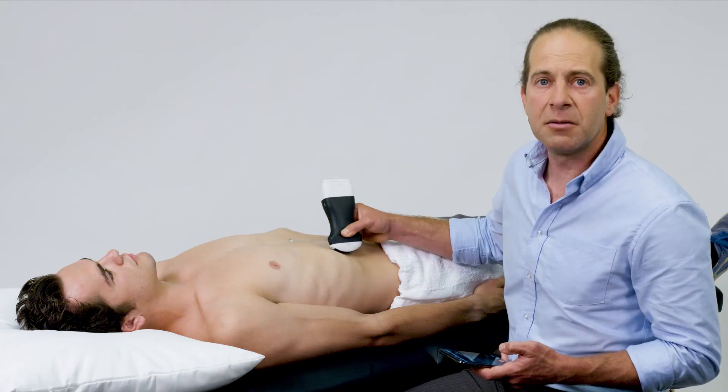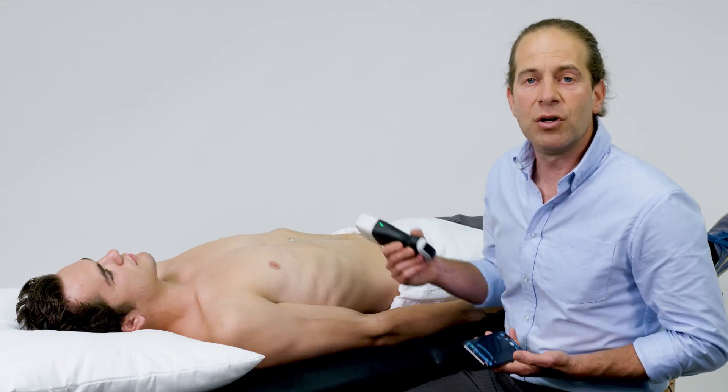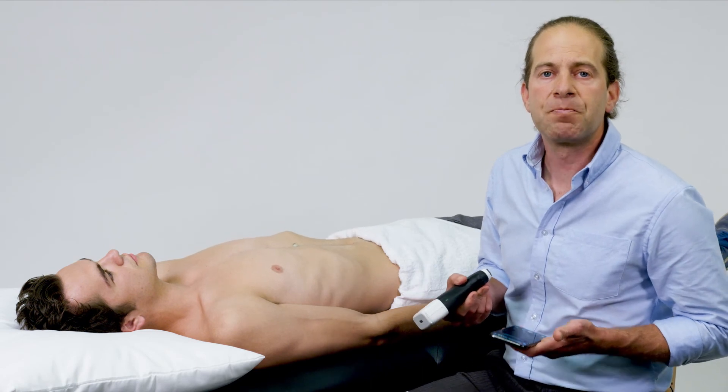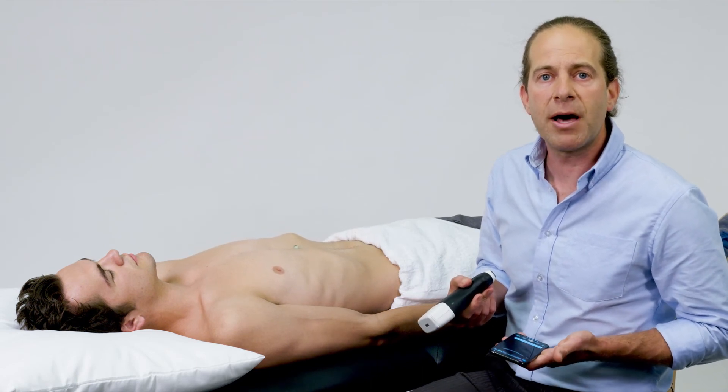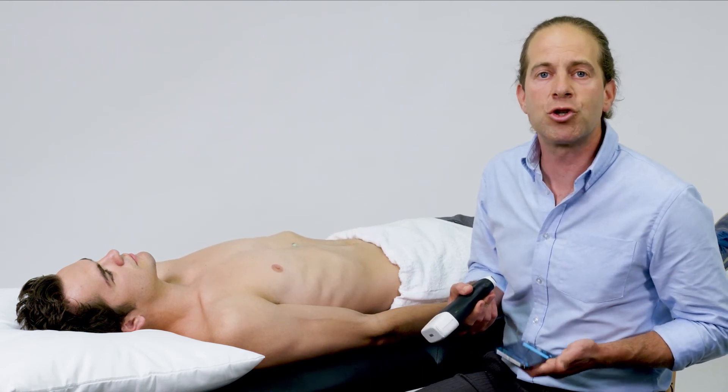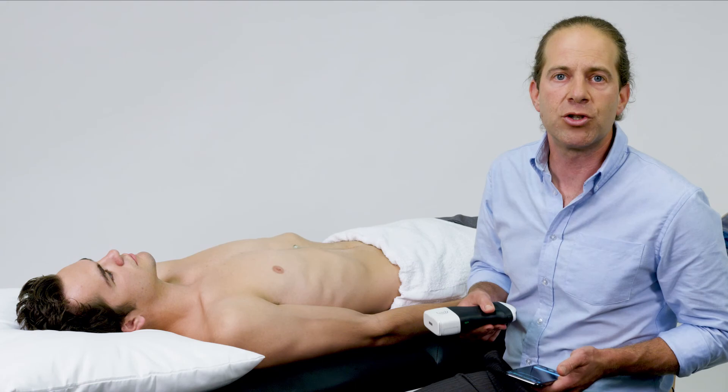With my scan completed, I can feel confident that there are no signs of stones in the gallbladder, inflammation of the gallbladder, or obstruction of the biliary tree.